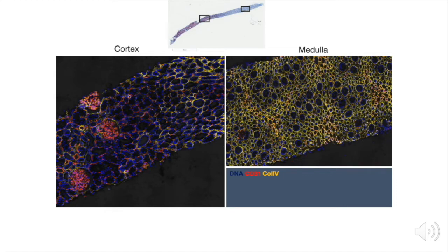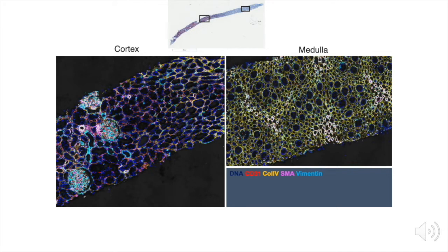By showing collagen IV in yellow, you can appreciate the striking differences in collagen content between cortex and medulla, which are also apparent on the trichrome image shown above. Here I am adding smooth muscle actin to highlight vasculature, as well as vimentin, which marks stromal cell populations, and WT1 in white, which marks podocytes.